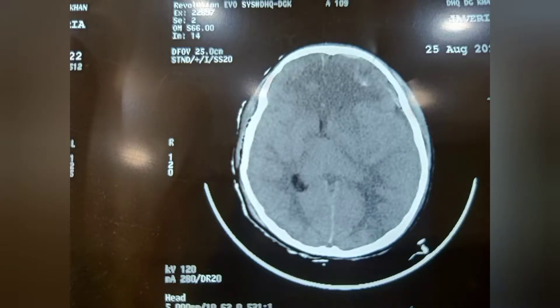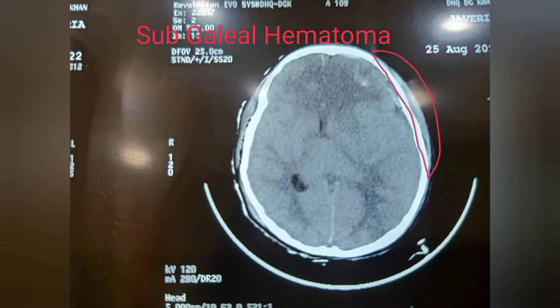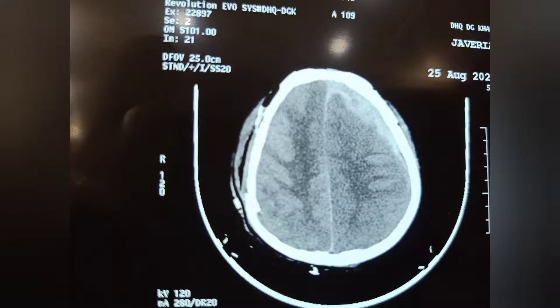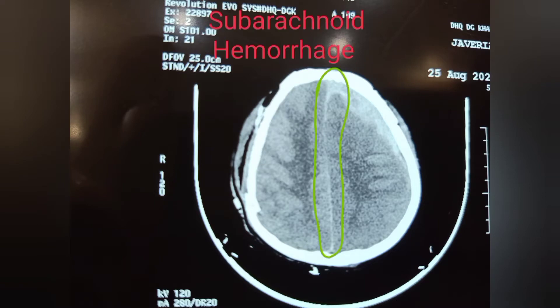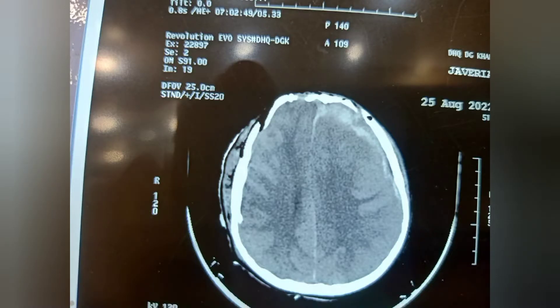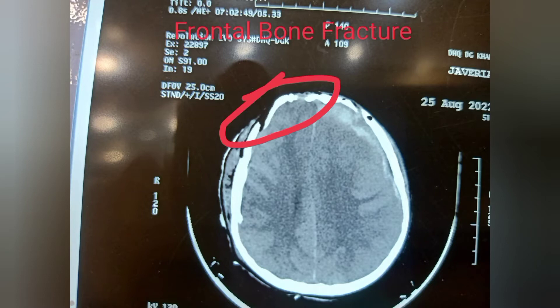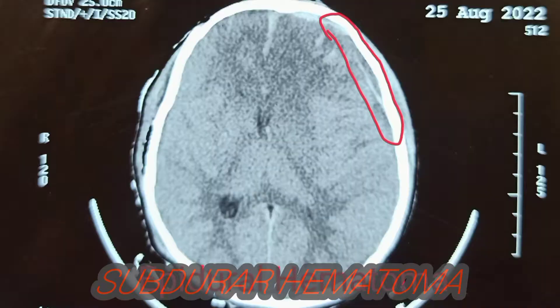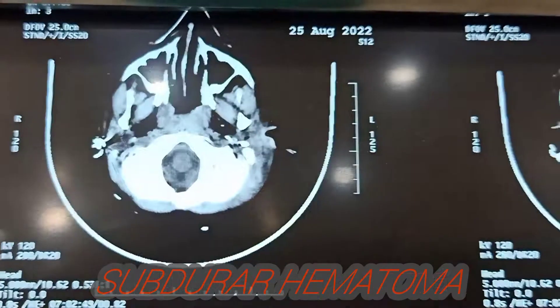Again you are seeing the plain film. There is a sub-galeal hematoma. Then showing the plain film again, and I will mark it. There is a subarachnoid hemorrhage, clearly seen with greenish marking. That's the frontal bone fracture. There are a lot of findings here. And now you are seeing on the screen there is a subdural hematoma.